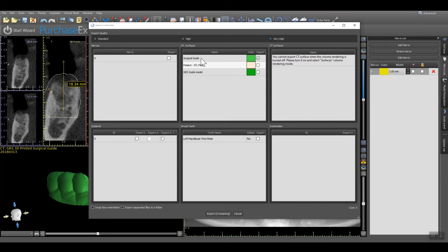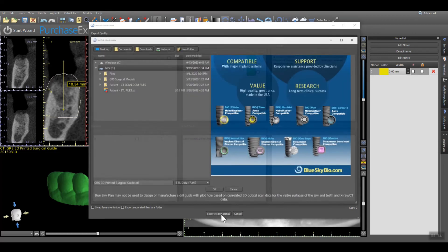However, to confirm the physical fit of the surgical guide and to confirm drill depth and orientation, it is highly recommended to 3D print a GRS model as well. Additional videos demonstrating how to create a GRS model using BlueSkyPlan along with the benefits for using a GRS model can be found at GRSGuidesystem.com.